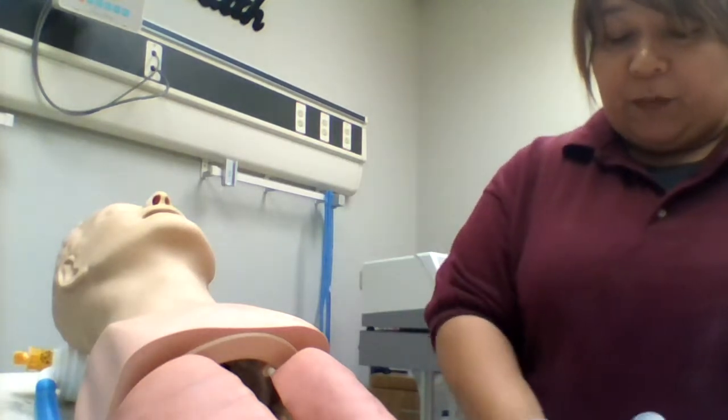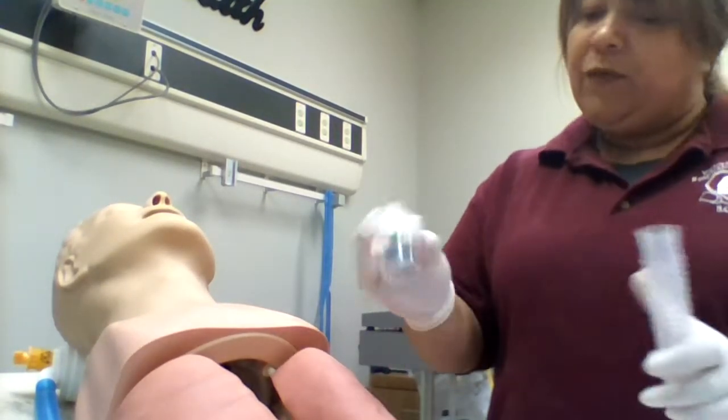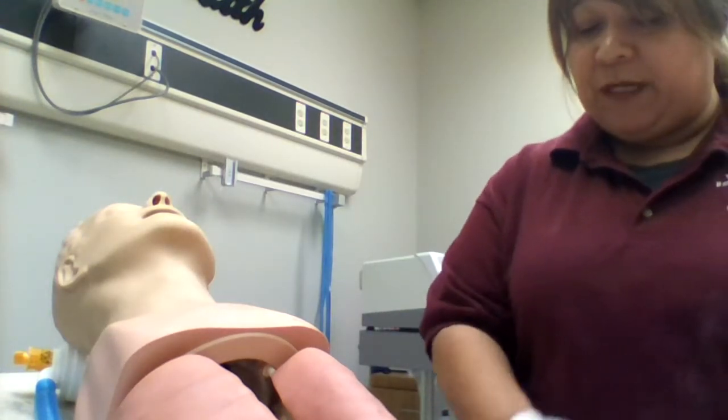Okay, so what we're going to do is we're going to take everything off. You're going to take the tubing and set it to the side along with your medicine cup. We're going to have your mask and your T-piece or your mouthpiece — that way we make sure we get everything clean.